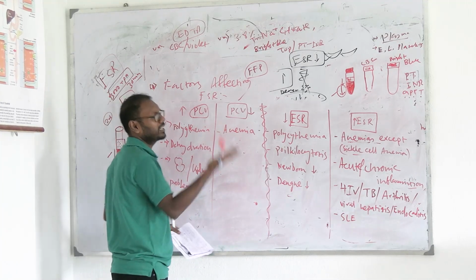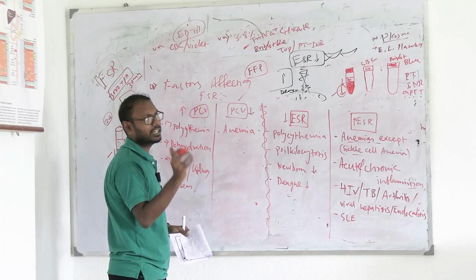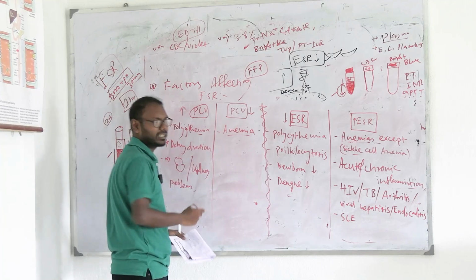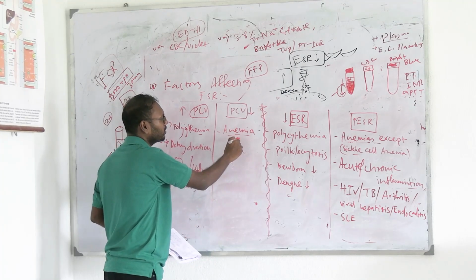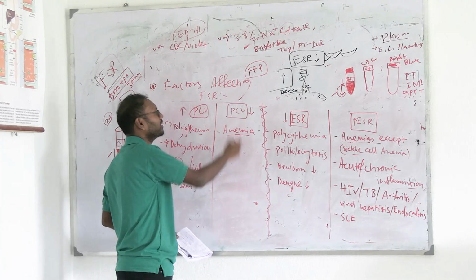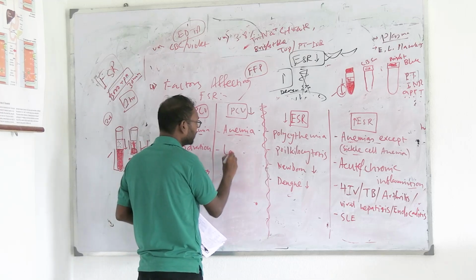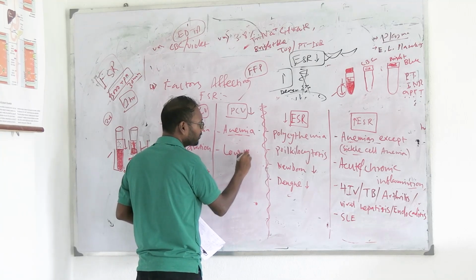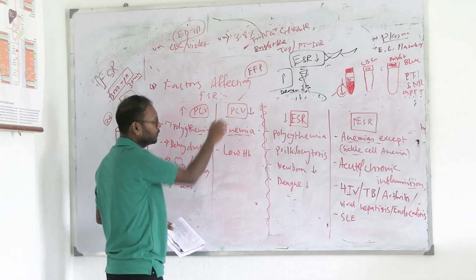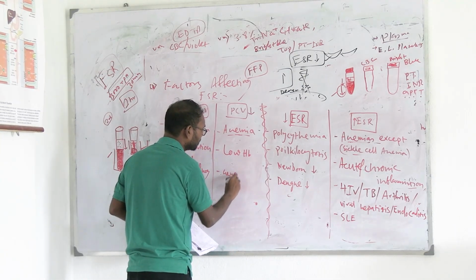Simple reason, when there is anemia there is less available cell to pack, mainly erythrocyte. এখানে দেখো anemia, erythrocyte কমে যাচ্ছে, ভলিউম কমে যাবে, PCV ও কমে যাবে, one reason done. Next, low hemoglobin, same, whenever there is low hemoglobin erythrocytes are low, PCV will be less. Finally, last reason being generalized weakness.